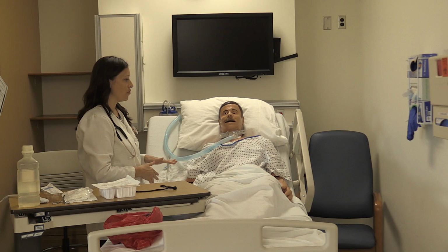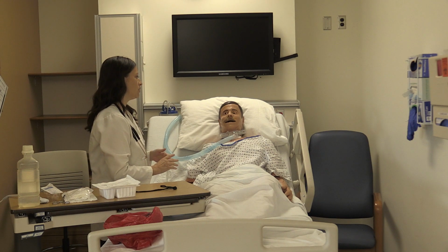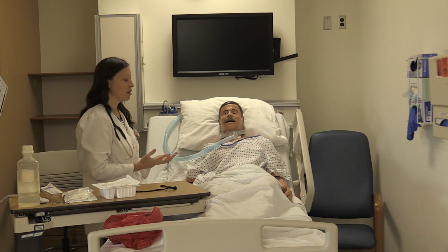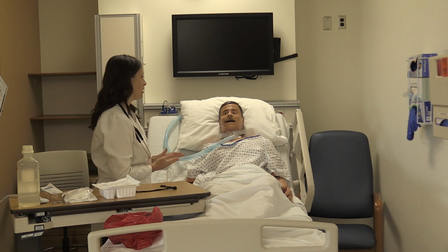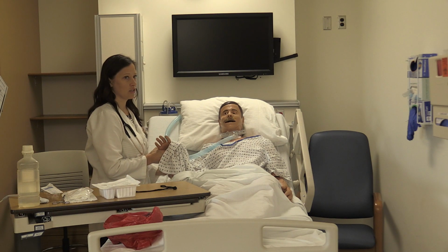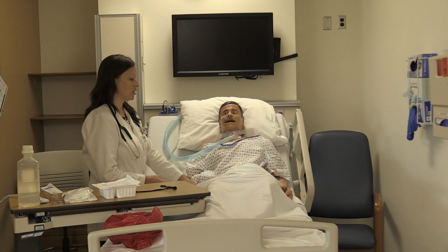One thing though about the procedure is, Mr. Smith, while I'm doing this procedure, it's going to be a little bit difficult for you to communicate with me, so you want to establish a means of communication with your patient. A good way to do that is, if at any point in this procedure you want me to stop or pause, go ahead and raise your left hand, as opposed to him raising his right hand closest to you and then grabbing you and your equipment while you're doing the procedure.